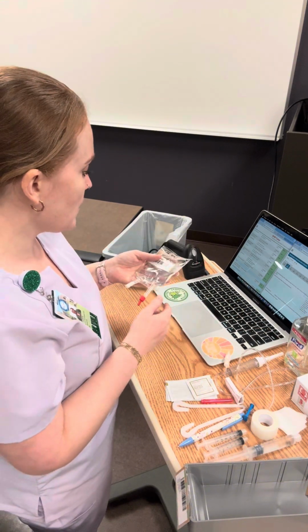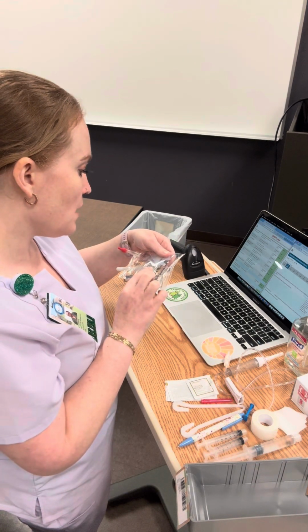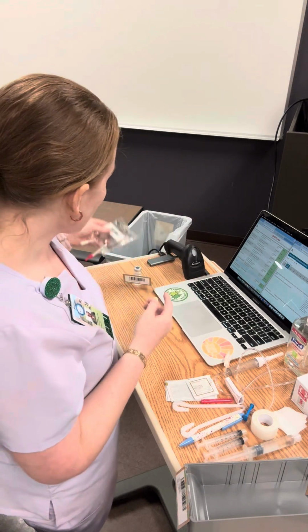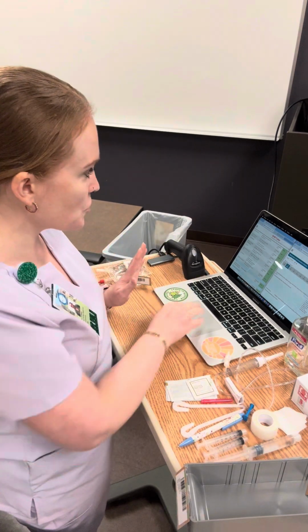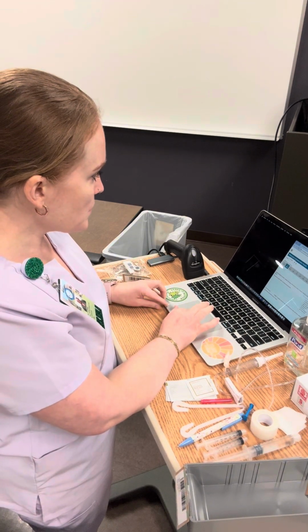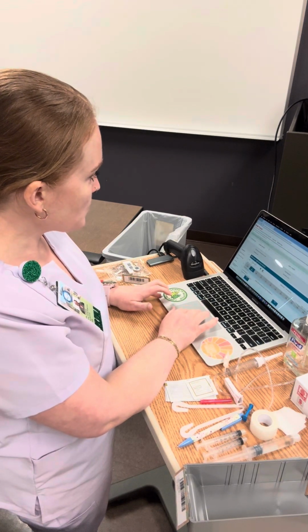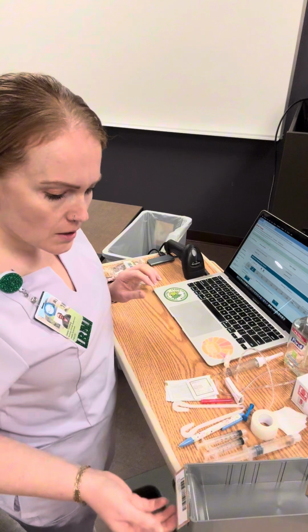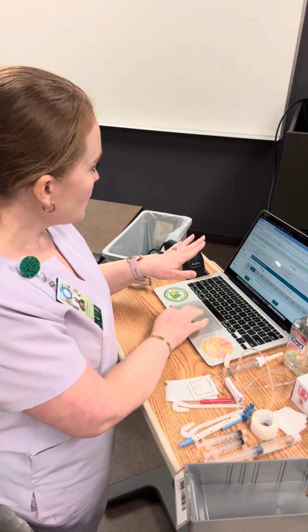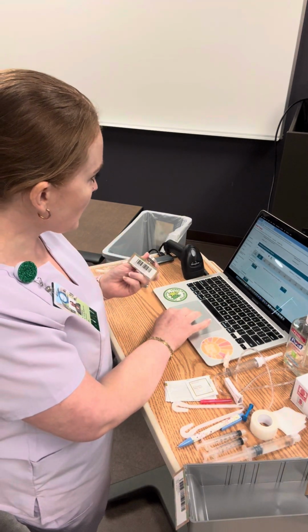It says 7:14 a.m. And the expiration date for this medication is going to be May of 2028, and I'm looking to see if there are any particles or any leaking, and this looks good as well. So I have now completed my MedCheck 1. I am going to minimize my orders, open up my MAR here, scroll up to look at the name again. So my med bin says Code Brown 61851. I have Code Brown 61851. I'm going to pick up my first medication.